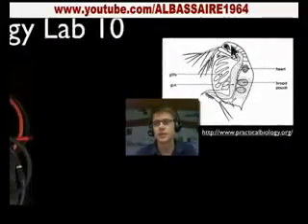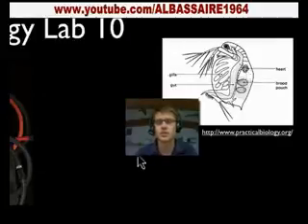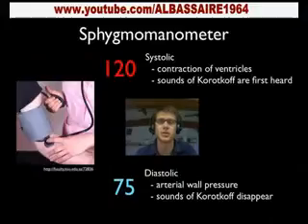Now, normally AP classes use Daphnia to study this. There's a heart in the Daphnia, and so you can just look at the beating, and then you can change the temperature. We actually do this with goldfish, and we decrease their temperature and observe how that affects their circulatory system. And so let's look at the sphygmomanometer.